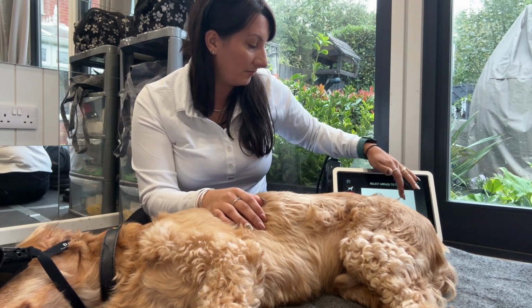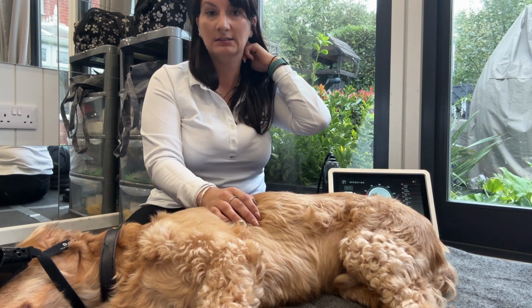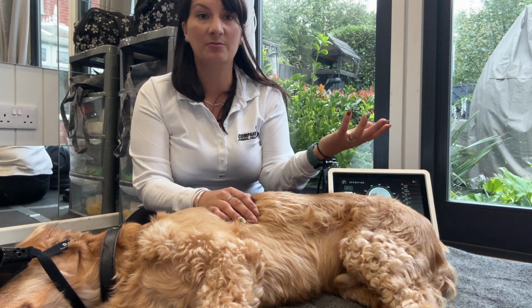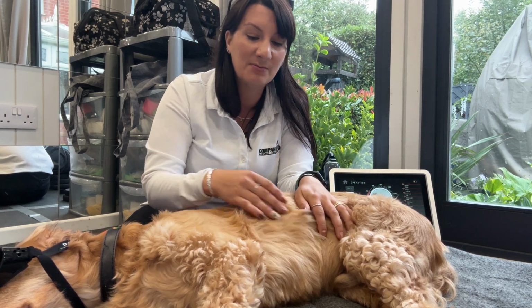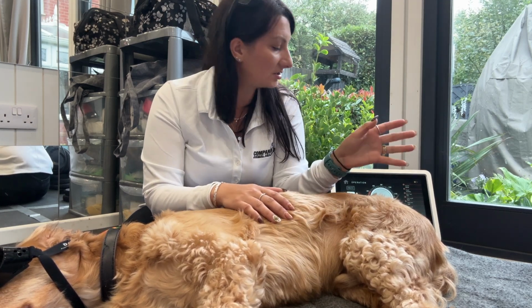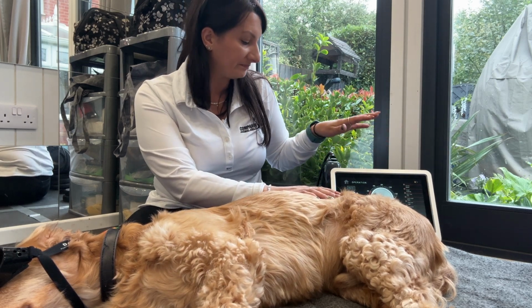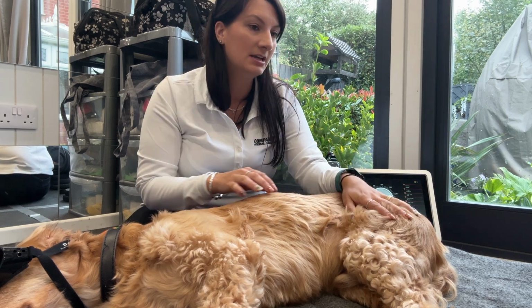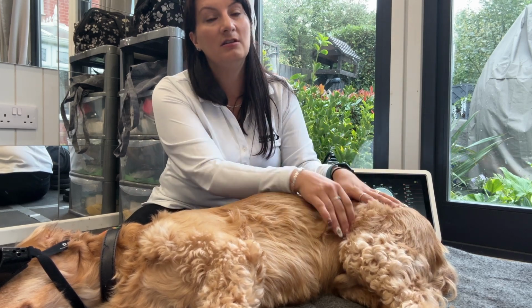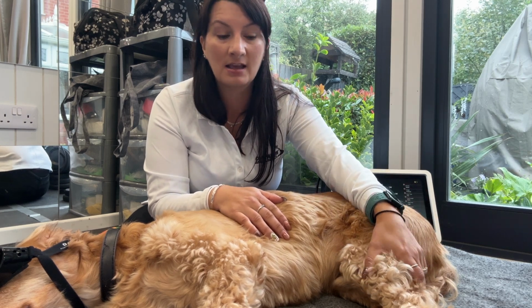So if I'm treating various areas on my laser, I personally like presets because I find it's quicker, it's easier, I don't have to calculate, but equally there may be times that I don't. So then my laser is going to be ready to go. Now I'm really lucky, I'm using a Companion CTX IQ, and one of the advantages of using that is that it has the intelligent handpiece.